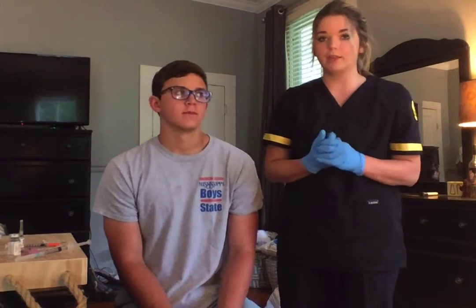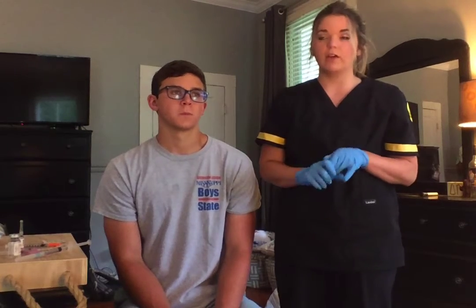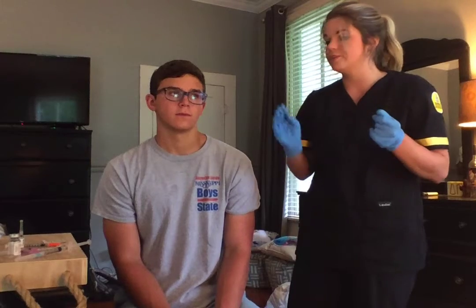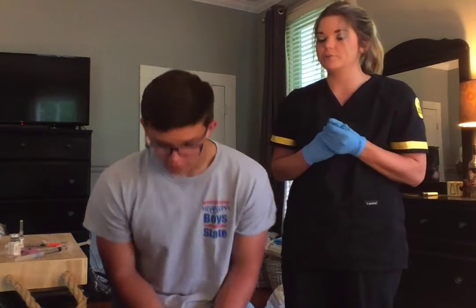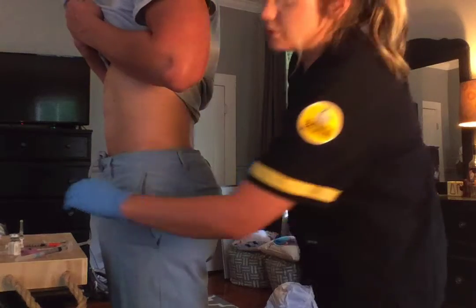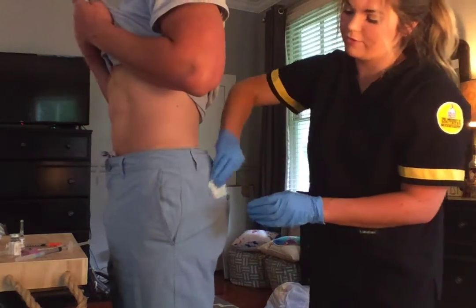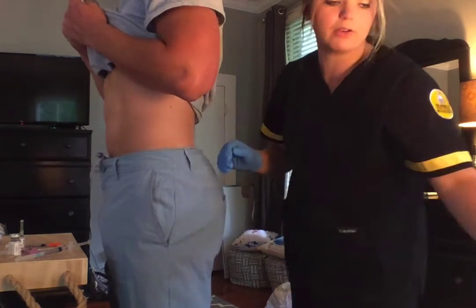This is an intramuscular injection, so I will be either giving it in the deltoid, the vastus lateralis, or into the ventrogluteal at a 72 to 90 degree angle. Since this is not a vaccination, I will not be giving it in the deltoid muscle, and the most preferred method is in the ventrogluteal, which is right here on the upper bottom. So for this, I'm going to do the same thing. I will take my alcohol swab, and I'm going to wipe off the area that I will be giving it in. So my alcohol swab down.